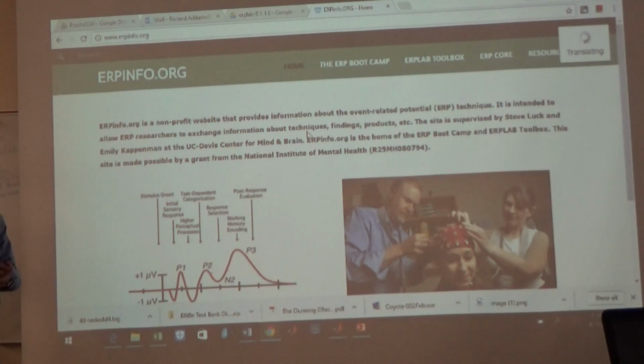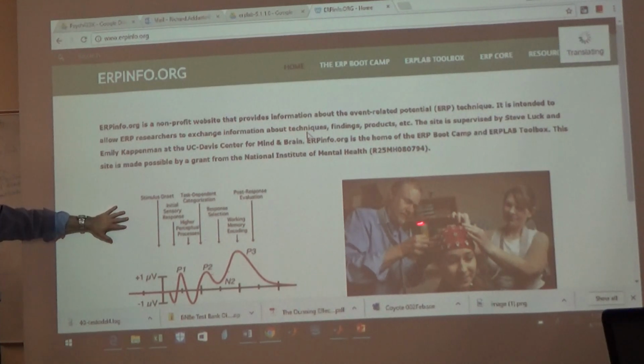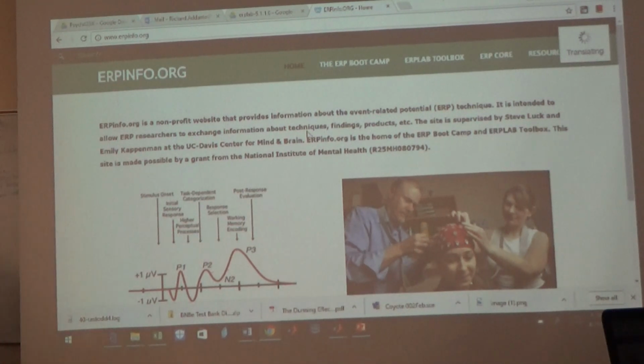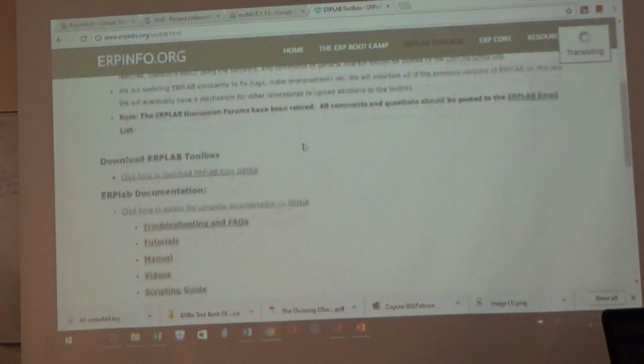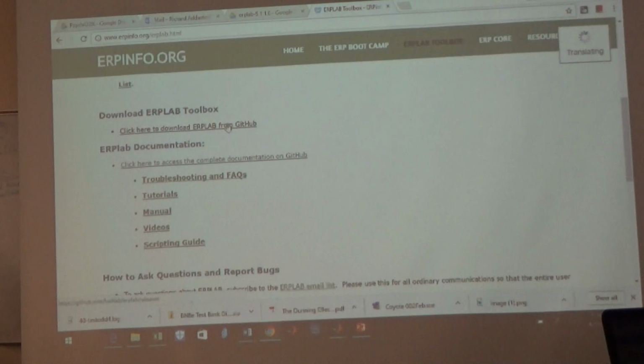Question, Vic? No. Okay. So if you come to erpinfo.org, this is the website of Dr. Luck. He wrote the textbook, he wrote a lot of the software. That's actually Steve Luck there with his assistant in the cabinet applying some ERPs. Okay. What we're going to do is navigate to download that. And we're going to go to ERPLab Toolbox. Okay. So you're going to go there. And we're going to scroll down to the option of download. Okay, we're going to click on that.